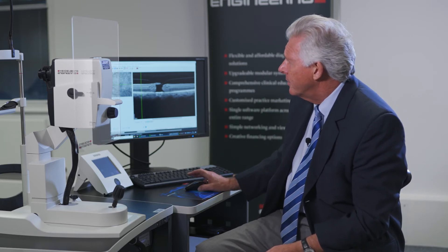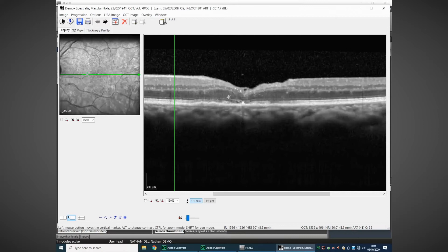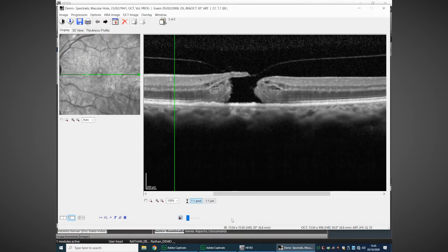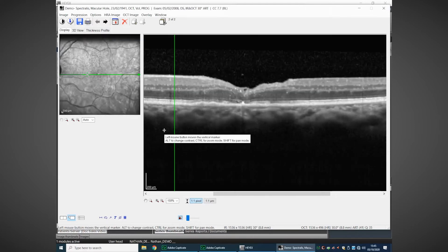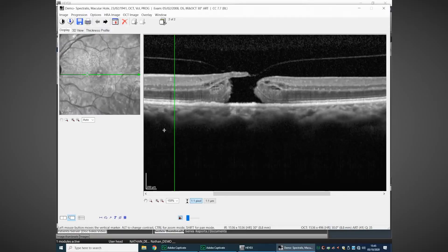With our eye tracking, we did a follow-up scan, and here it is — you can see that the retina is back in position and the external limiting membrane is nicely in place. We can flick between the baseline and follow-up exam. Notice the shadow from this vessel between baseline and follow-up doesn't move, so you can be confident those scans are very accurate and you can track follow-up well. In this case, you can also show your patient how nicely the procedure went and perhaps the reason why their vision came back.